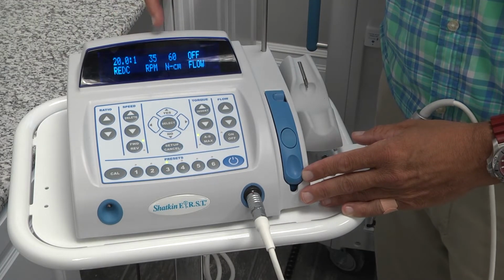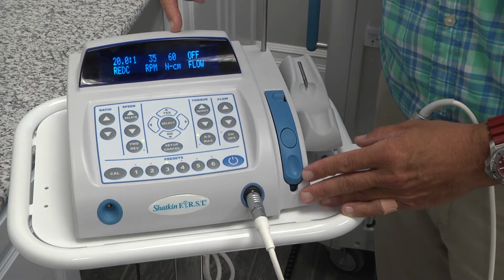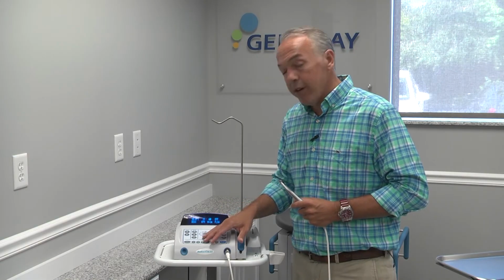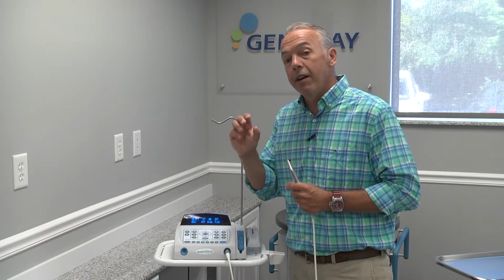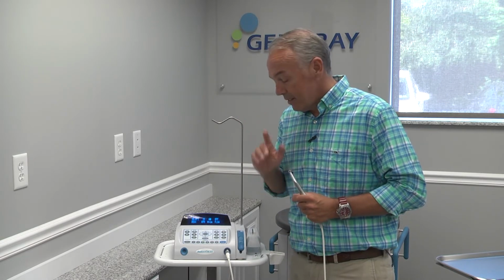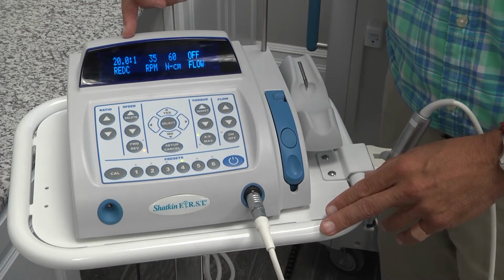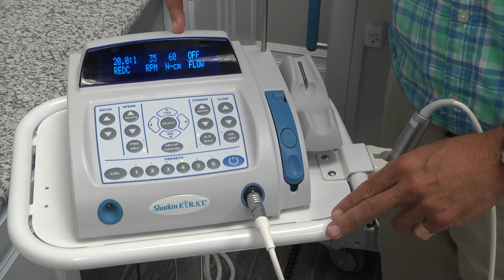Number three, final implant placement. 20:1 on the ratio, 35 RPMs, so the speed hasn't changed. We move up to 60 Newton centimeters of torque and no irrigation as well. So now, at this point, we should have the implant fully placed. What I mean is the ball and square are above the tissue. The bottom of the square is level with the gingiva. Very important. Number four, if for any reason we did need to reverse the implant, same ratio, same speed, and we're at 60 Newton centimeters of torque to get it out.